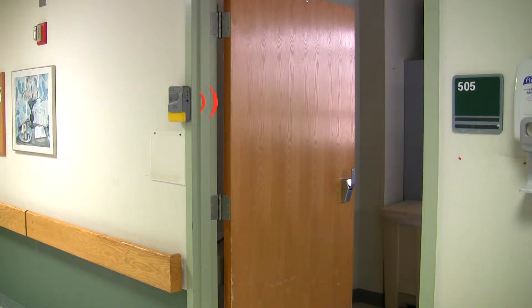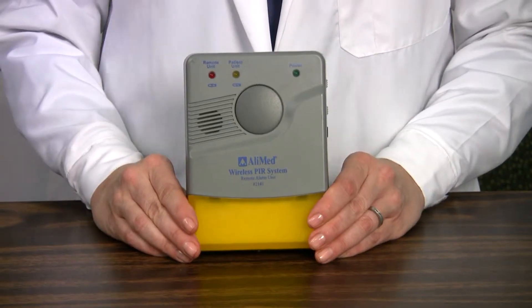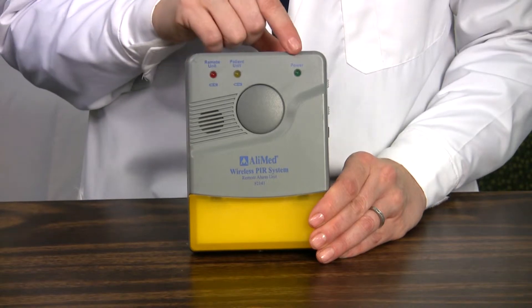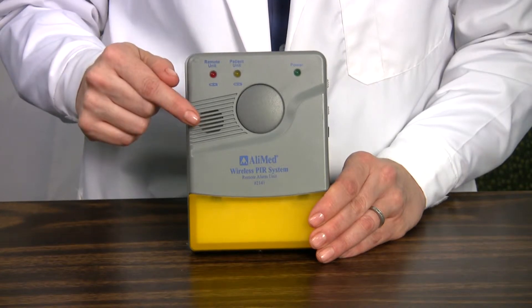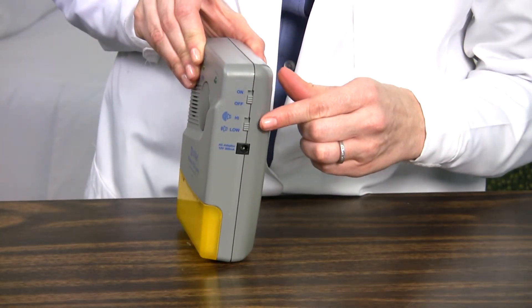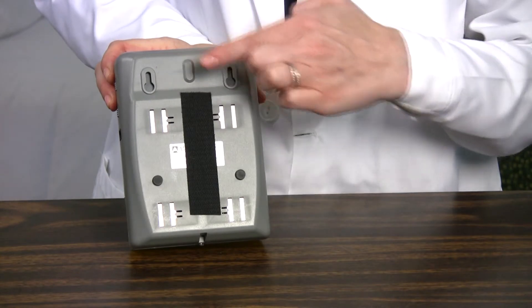System 4 also comes with a remote receiver unit which communicates with the alarm unit to extend the range of the sounding alarm by up to 100 feet in any direction. On the front is a series of three alert lights: a low battery indicator for the remote unit itself that illuminates red, a patient unit low battery indicator that illuminates yellow when the PIR alarm unit battery is low, and a green power on indicator. The front also contains the alarm speaker and the corresponding flashing alert light. To the side is the power on-off selector, just below is the high-low volume selector, and below that is the AC adapter port — you may order an AC adapter separately.